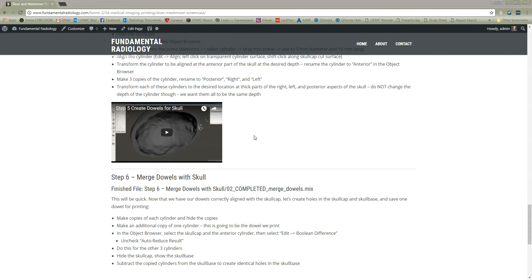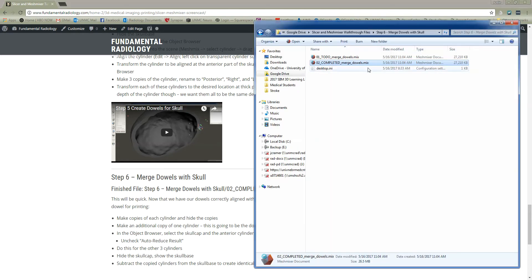This will be quick. Now that we've created all our dowels and aligned them with the skull, we're going to use those to create holes in our skull cap and our skull base, and then keep one dowel for printing. So this is step six: merge dowels with skull. If you're following along in the tutorial and accessing the files at neurorad.link/skull-files, you'll see there's a step six merge dowels with skull folder.